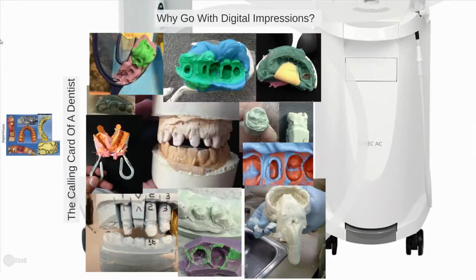Without question, PVS impressions may continue to have a place in the dental industry for some time, but thankfully, digital impressions allow us to get a more precise impression efficiently.